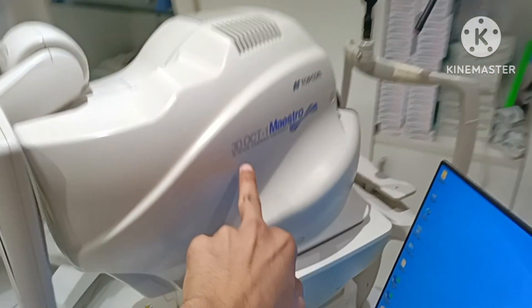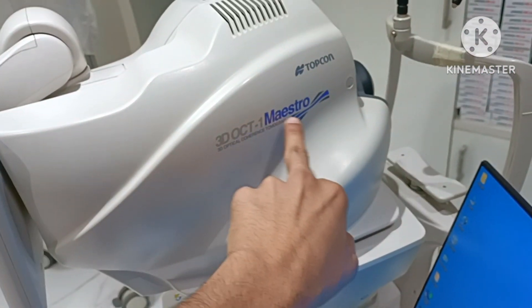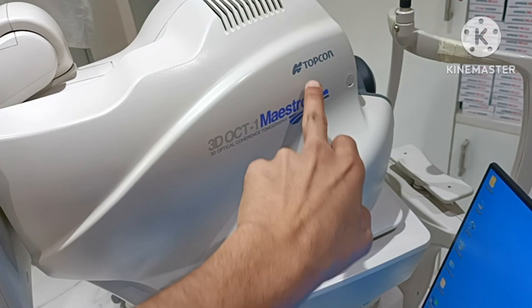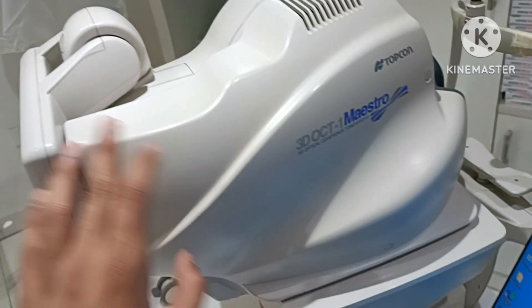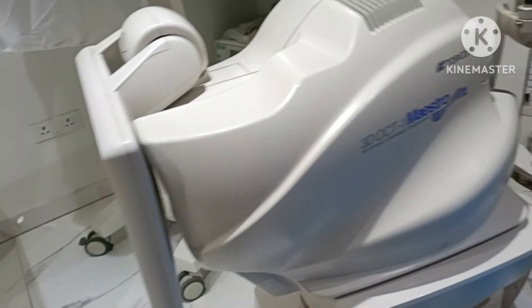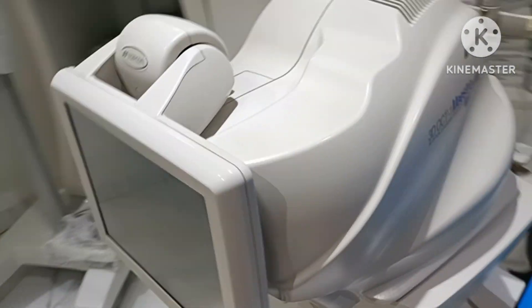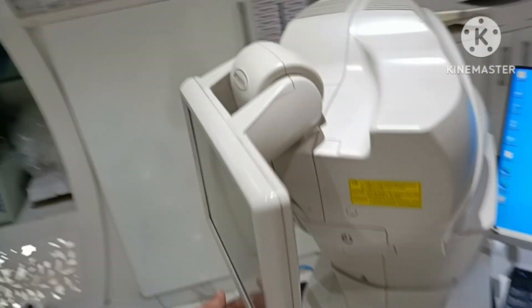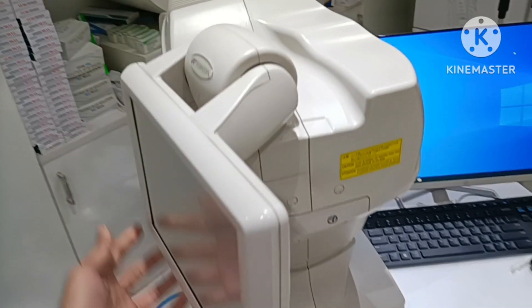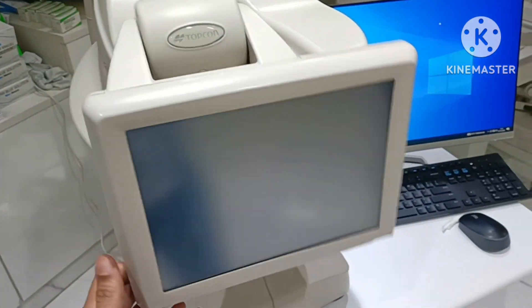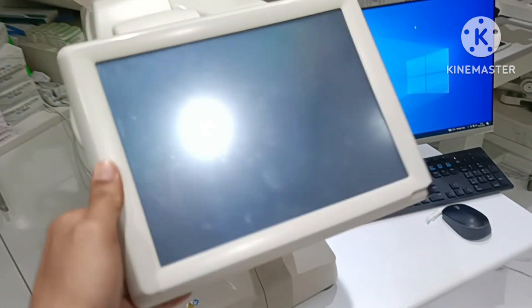3D OCT-1 Maestro 1 Topcon without angiography, tiltable head, model 2015.